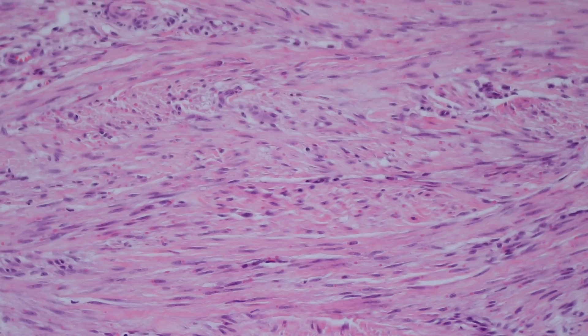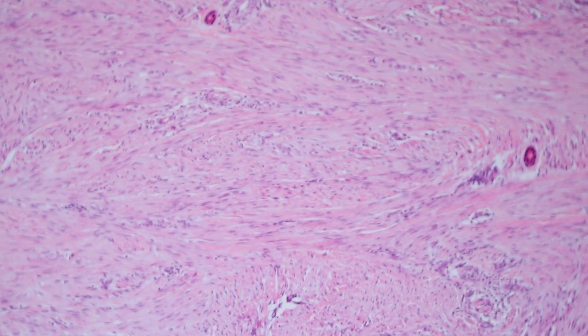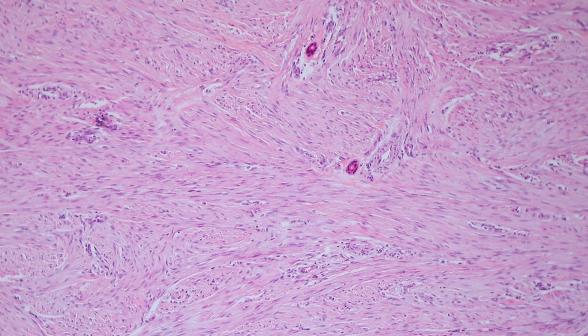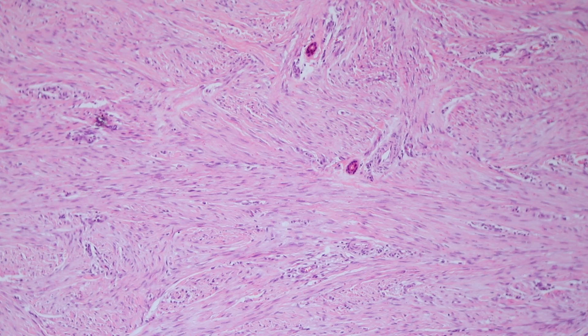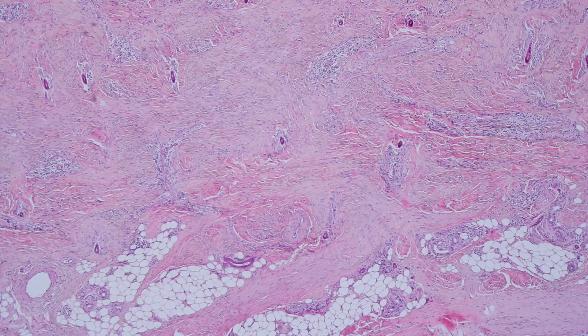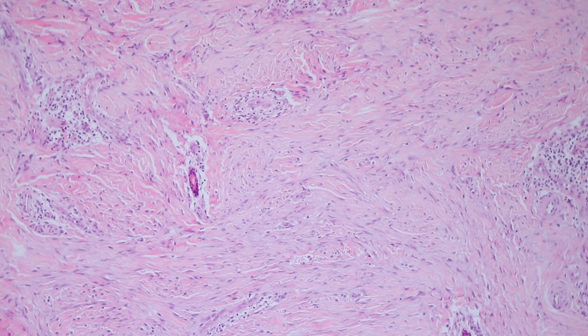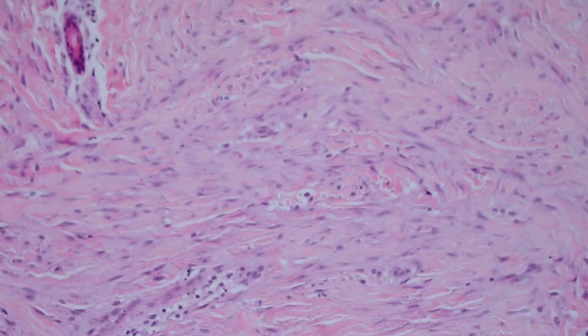It does recur locally, but it's not an aggressive lesion and it's not malignant. It's important to distinguish this from desmoid tumor, but with this clinical history, with these inclusion bodies, and with the lesion being centered in the dermis, you should basically never have that problem, because desmoid fibromatosis wouldn't look like this. Here you can see some of the fascicle growth — here's a fascicle pushing down into the subcutis — but you can still see those nice little pink inclusion bodies, which are the hallmark of this disease.